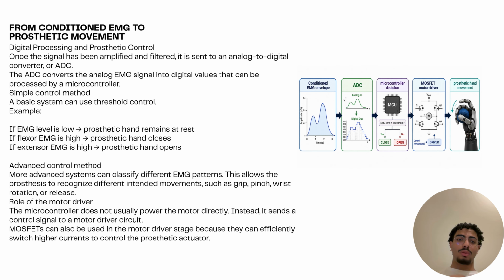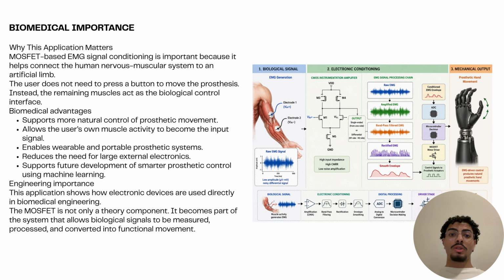MOSFETs can also be used in the motor driver stage because they can efficiently switch higher currents to control the prosthetic actuator. So, in this final stage, the conditioned EMG signal becomes a digital decision, and that decision becomes a prosthetic movement. So, now let's talk about the importance.